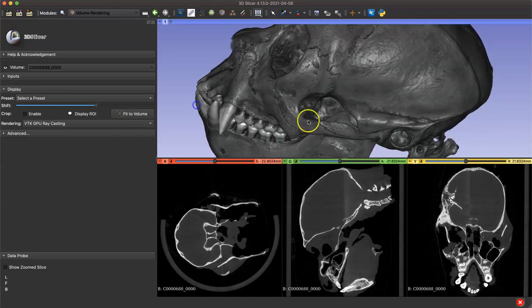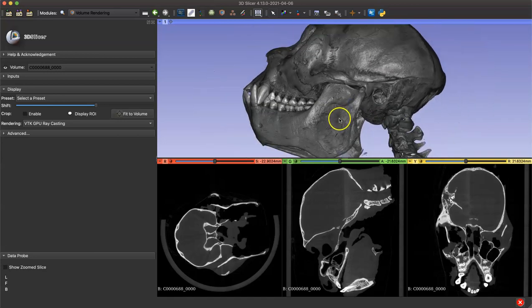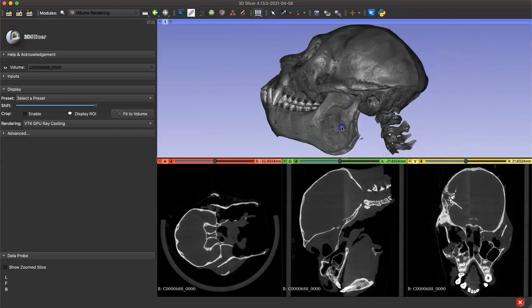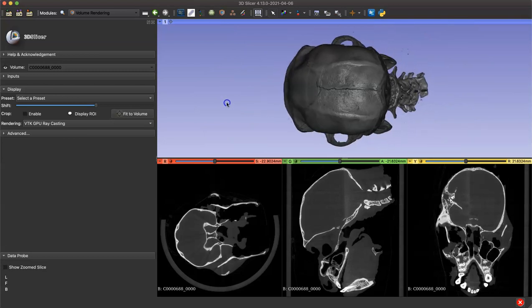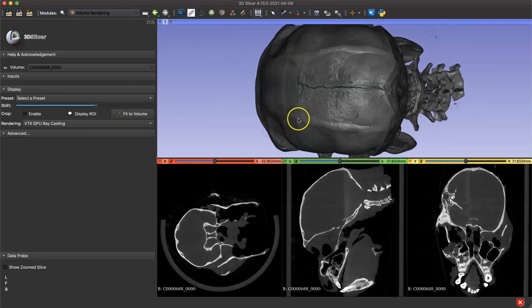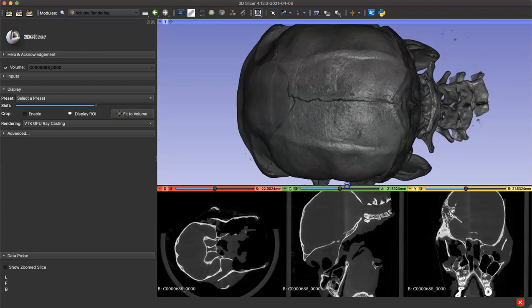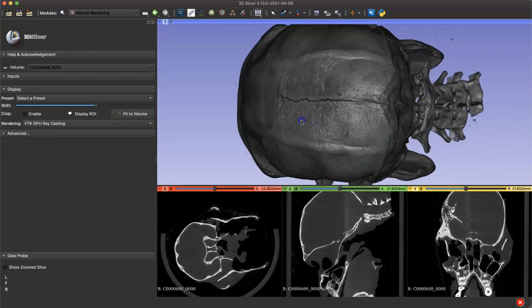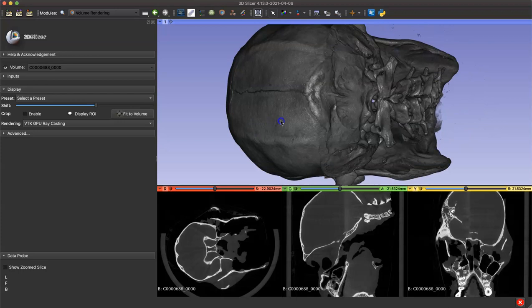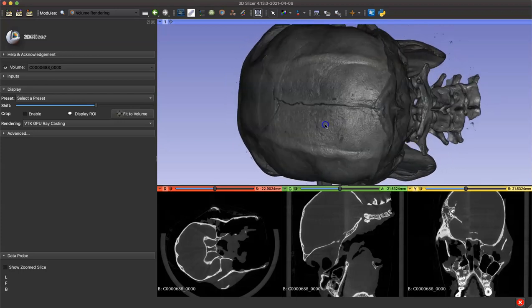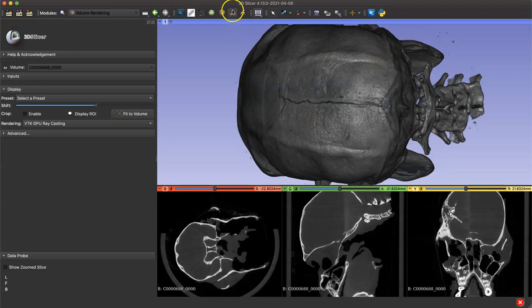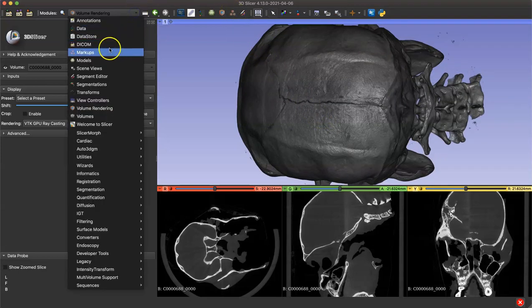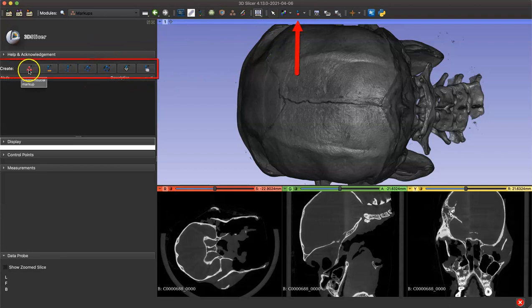We'll take our actual landmarks in the markups module, but before you place a point you want to rotate your model into the position that's best for whatever specific points you're taking. Remember you can also adjust those windows as you like. I'm going to be putting points down on bregma and lambda, so I'm rotating the model to visualize the top of the skull. Now I'm going to navigate to my markups module.